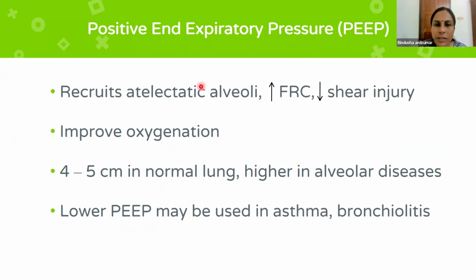And PEEP, PEEP also was discussed yesterday, right? PEEP is the positive end expiratory pressure. What is the pressure in the airways at the end of expiration? So a positive PEEP will recruit the atelectatic alveoli. It will increase the FRC and decrease the shear injury.